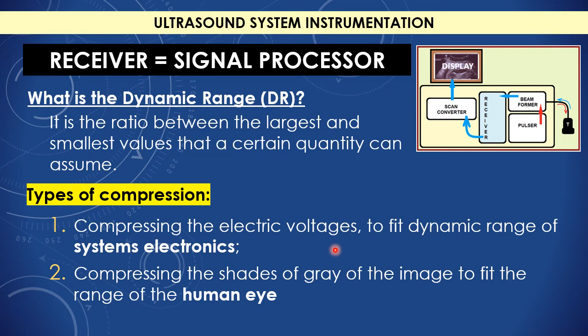So our eyes are limited in their dynamic range, right? And they say that the dynamic range is 30 shades of gray that our eyes can see at each particular time. Some people say that our eyes can go from the too bright to the too dark, but we can take this gradually, right?